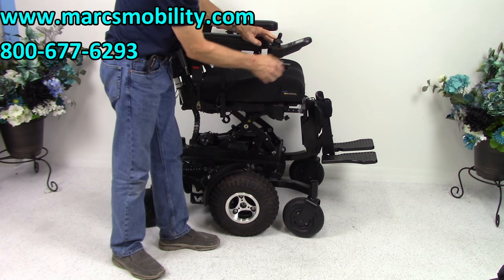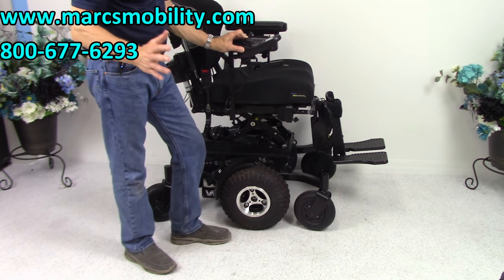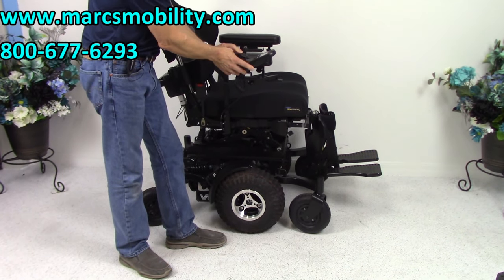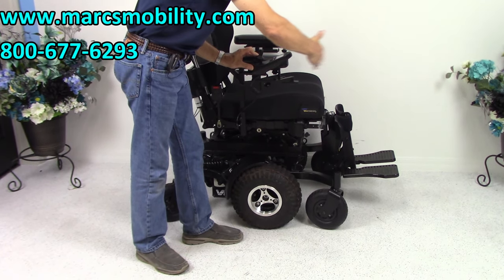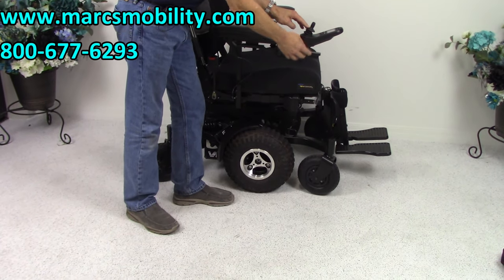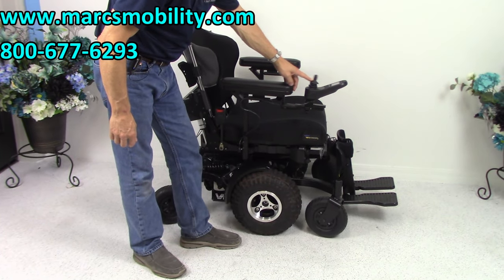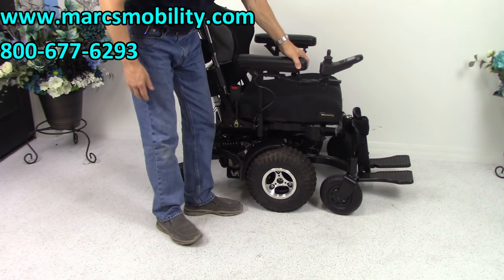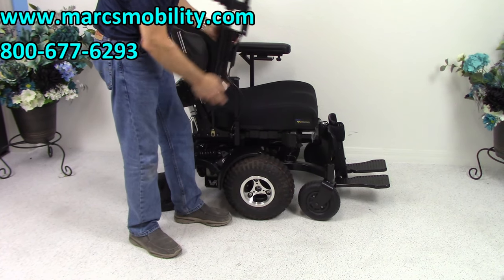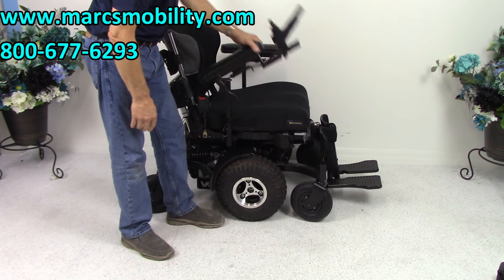So here you've got a swing-away joystick. If you're left-handed, we can switch the joystick to the left side — no problem at all. It's called a swing-away joystick, and it's great because you can get closer to a table. The joystick locks back up once you return it to the front. On this chair the arms do raise up — there's a little lever right here; push it forward and the arms will raise up.